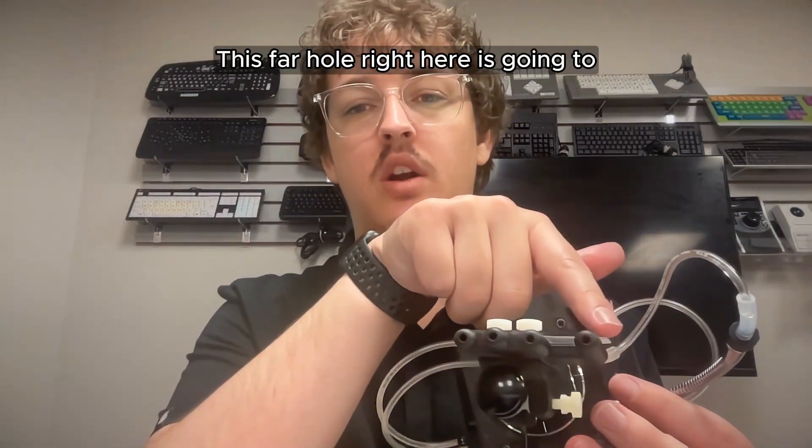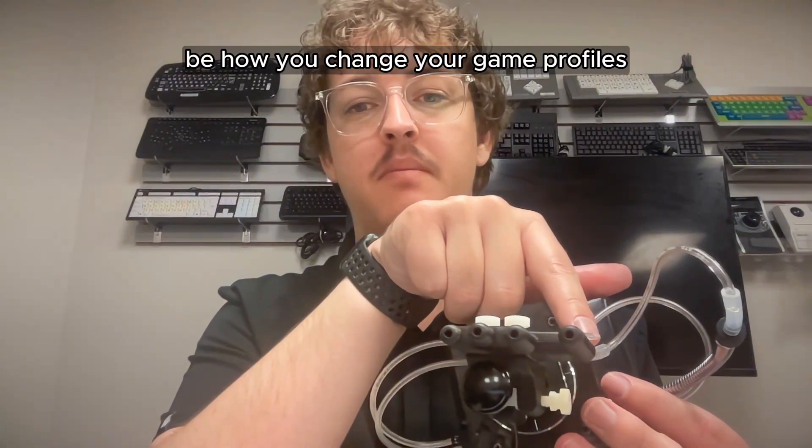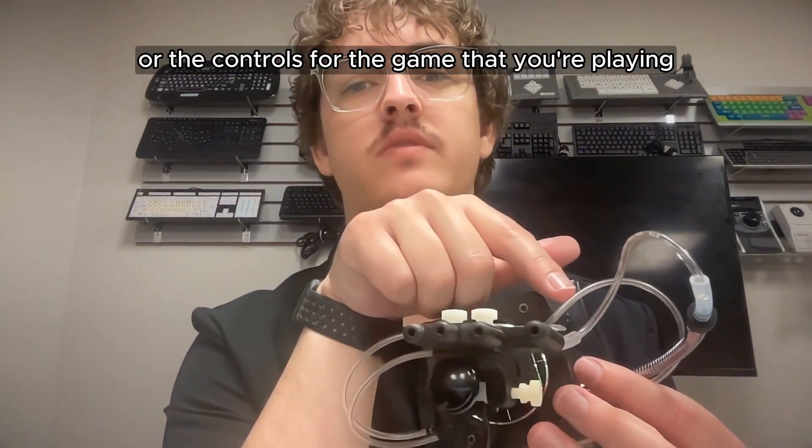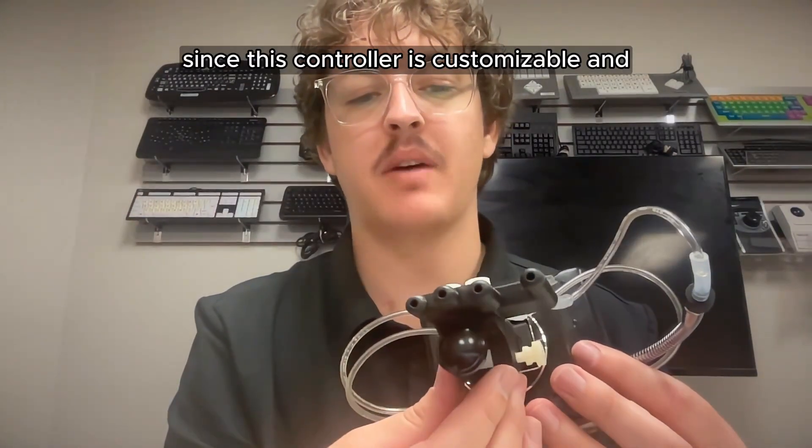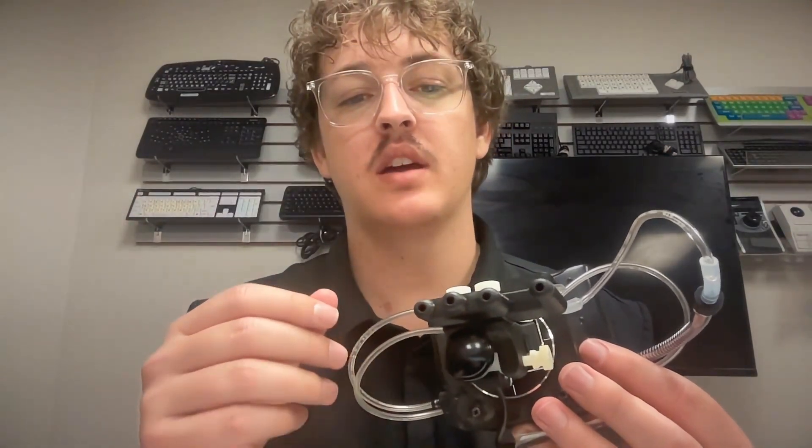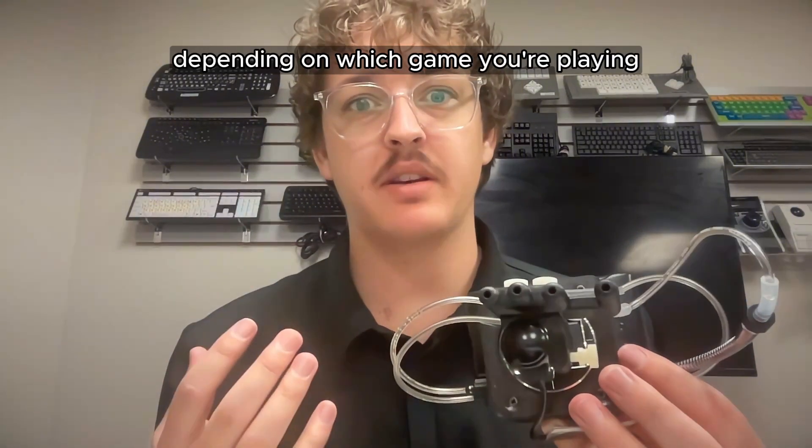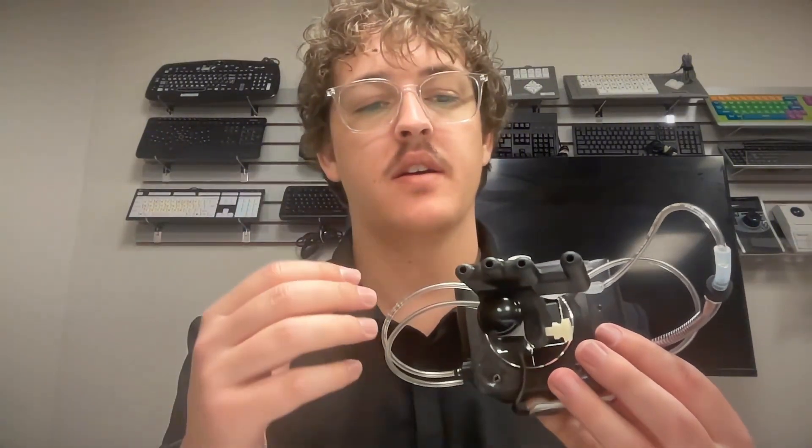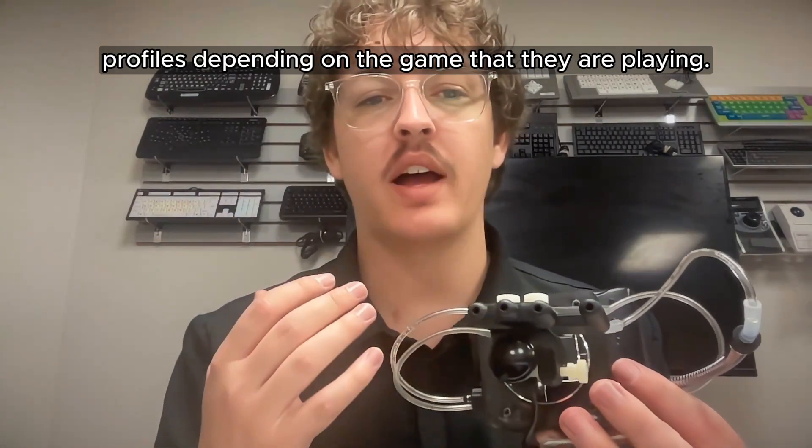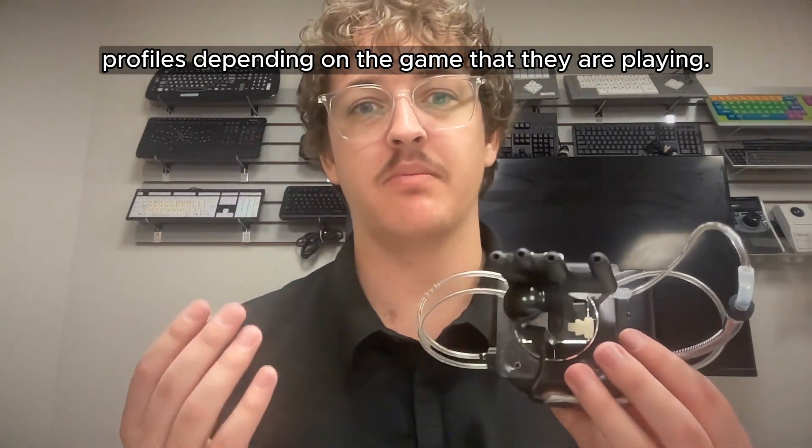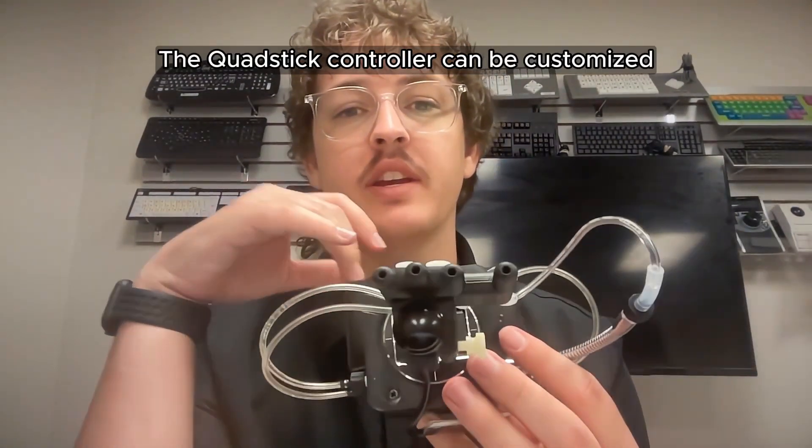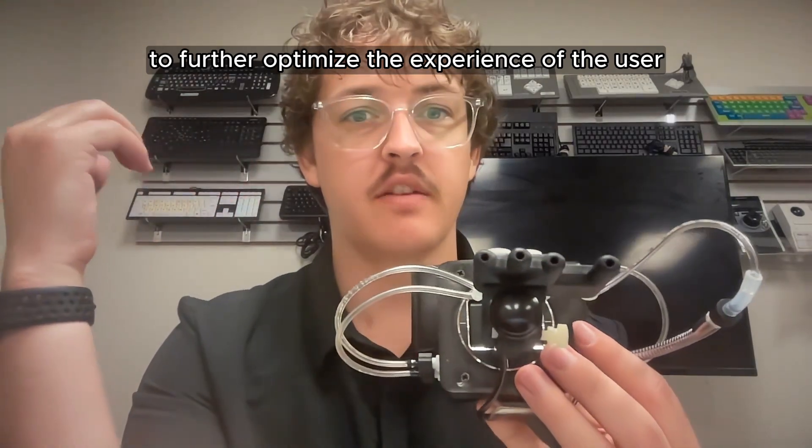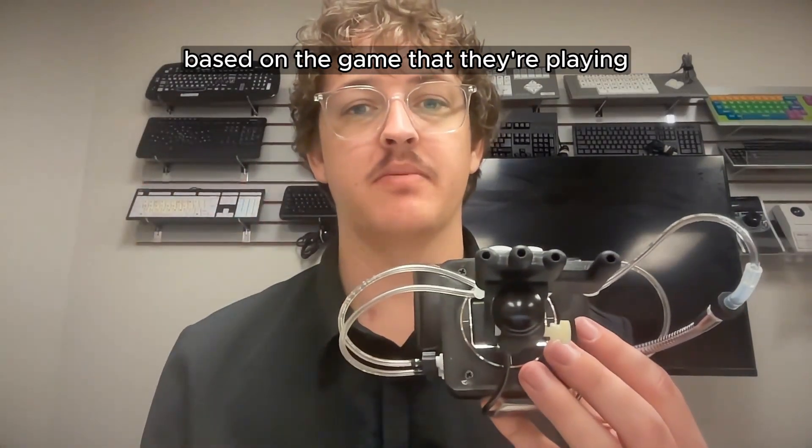This far hole right here is going to be how you change your game profiles or the controls for the game that you're playing. Since this controller is customizable and it may be different depending on which game you're playing, it is beneficial for users to have different game profiles dependent on the game that they are playing. The QuadStick controller can be customized to further optimize the experience of the user based on the game that they're playing.